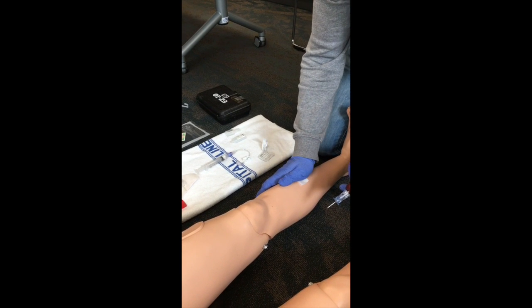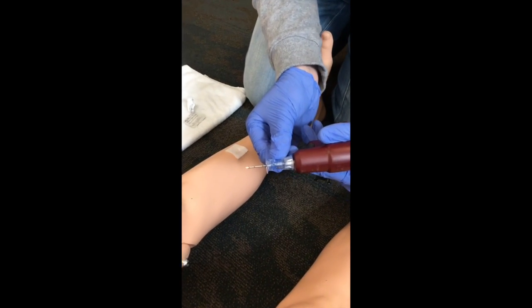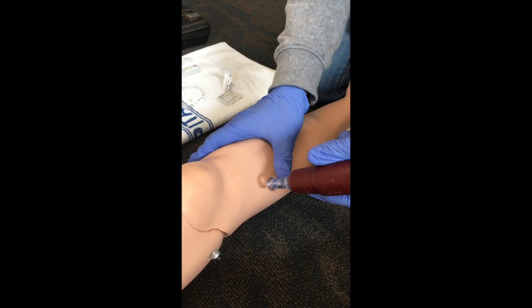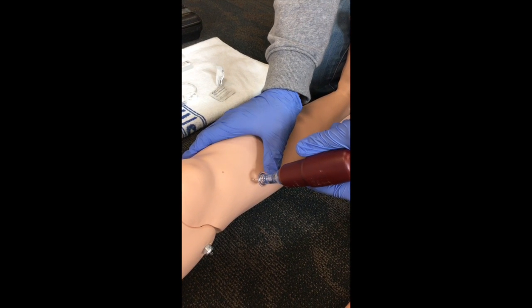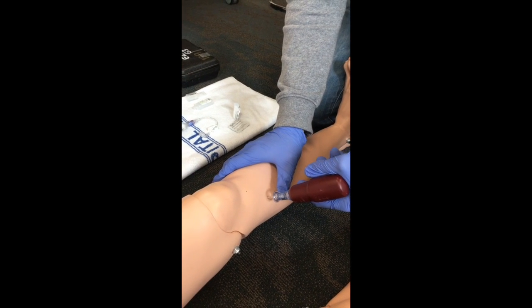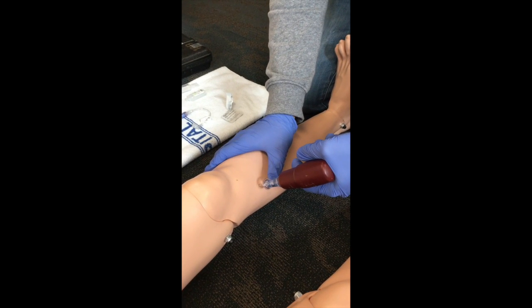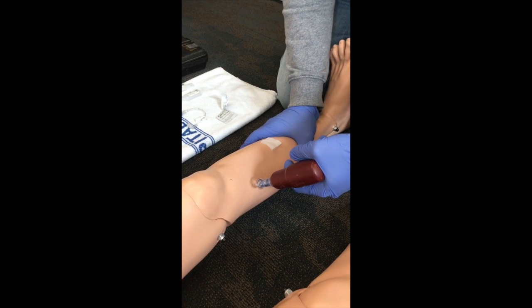Firmly push the needle through the skin at 90 degrees until the tip of the needle touches the bone. Verify that the 5mm mark is still visible — if not, you might need to attach a bigger needle. Stabilizing the limb and maintaining steady light pressure at 90 degrees, power the driver on by squeezing the trigger continuously. There will be a loss of resistance as the needle enters the medullary space.